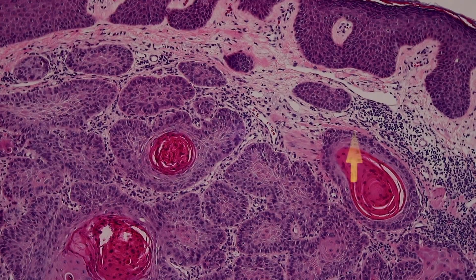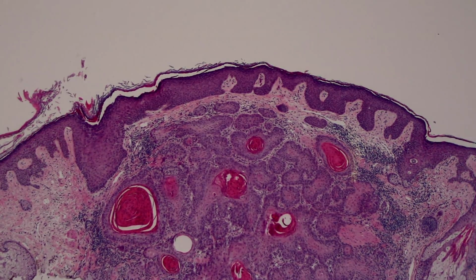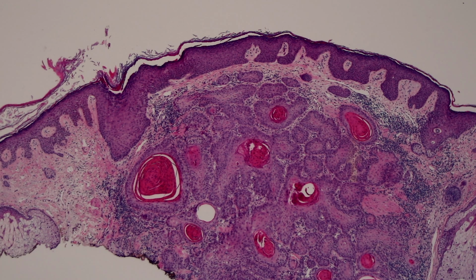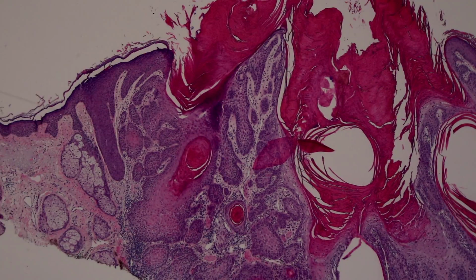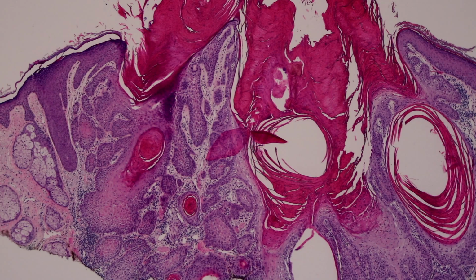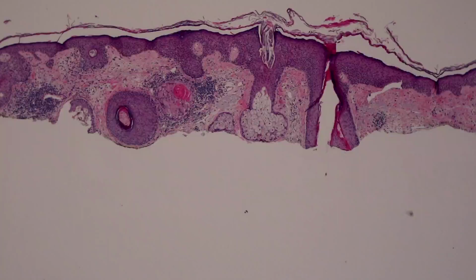And then sometimes what you get is, right here, squamous cell carcinoma only in the dermis. Now, the problem with this is that this is what a metastatic squame would look like, say a squamous cell carcinoma of the lung or some other site in the body. If that metastasized to the skin, it would make a nodule in the dermis with no connection to the epidermis. But depending on where you section through a primary cutaneous squame, sometimes out at the periphery you'll see areas like this that just invade the dermis. So the clinical is important. On a biopsy, if I see this, I will think about the possibility, could it be a MET? But I all the time see cases where there's just dermal squame, and it's because right next door there's a connection to the epidermis. We just can't see it in the area we've sectioned because it's a crater-shaped lesion.